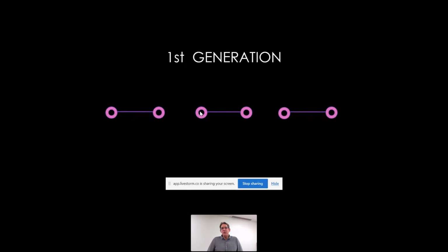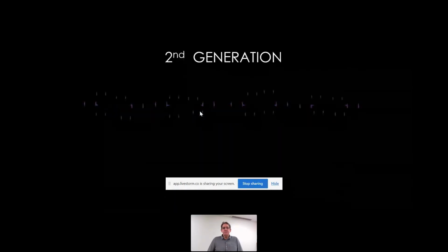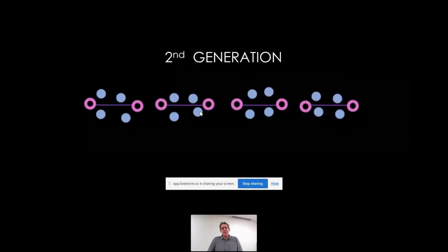They had long intraoral working and set times, and they weren't dimensionally very stable. So they introduced second generation, and this is what the majority of the vinyl materials are today. What they simply did is they added surfactant to the formulation. A surfactant is a moisture displacing agent. It helps to displace that moisture.